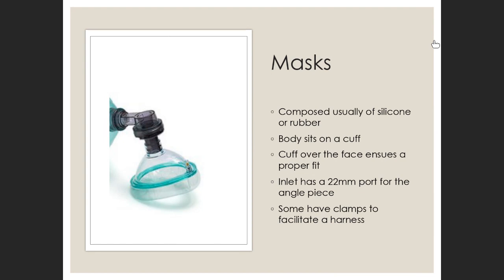What is the main drawback of the LMA? It is not a secure airway. Good, correct. So we do have to think about who we put it in and how we use it, but it is the easier airway to train persons to do.